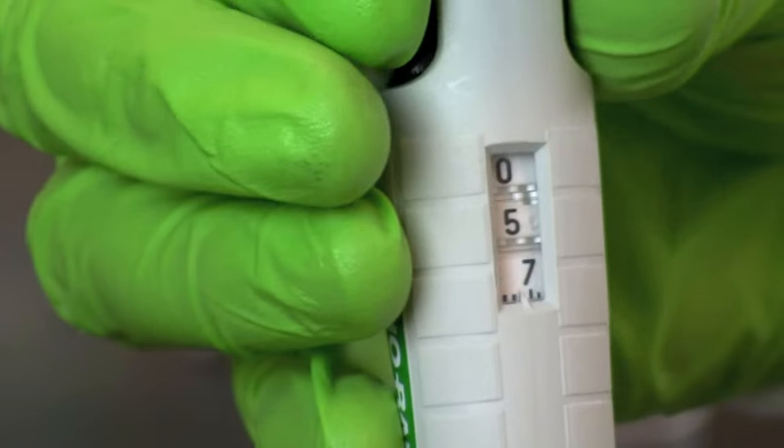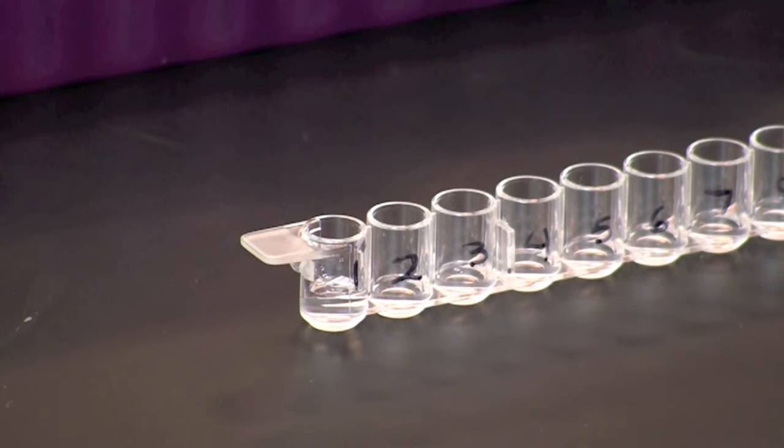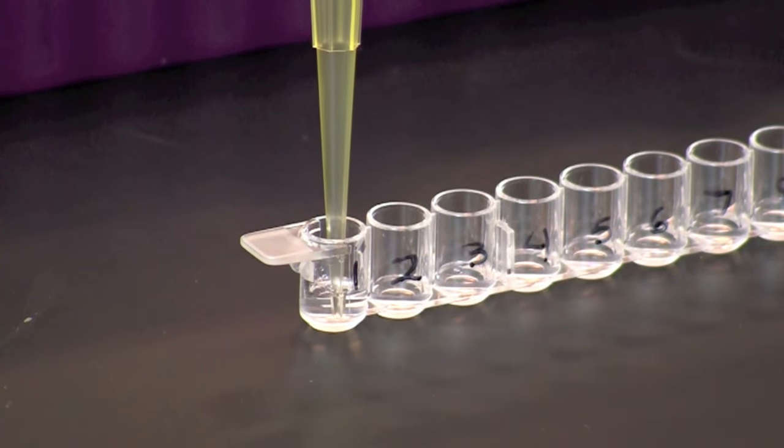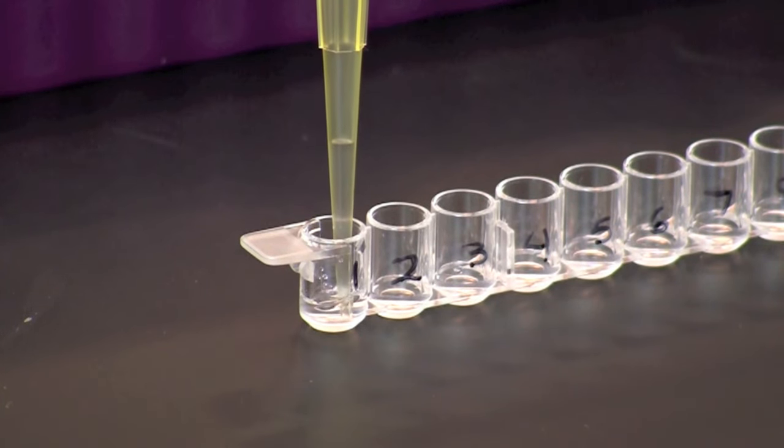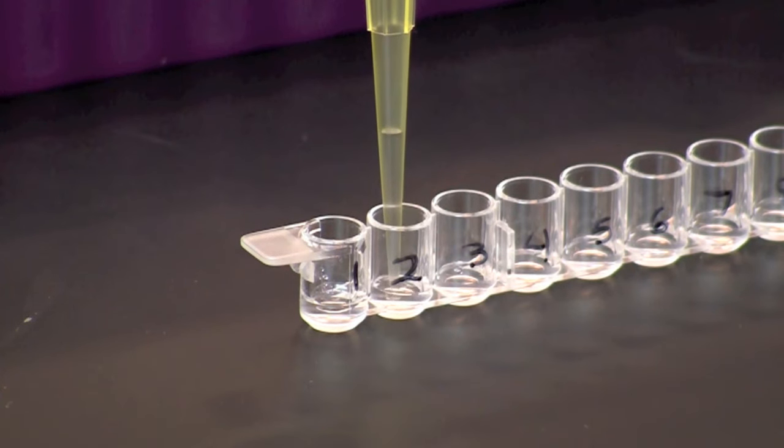The next series of steps will guide you through performing a serial dilution from well number 1 through well number 11. First, set your pipette to 50 microliters. Pipette 50 microliters out of well number 1 and add it to well number 2. Pipette up and down gently 3 times to mix the sample in well number 2.